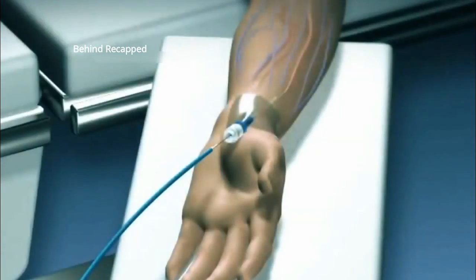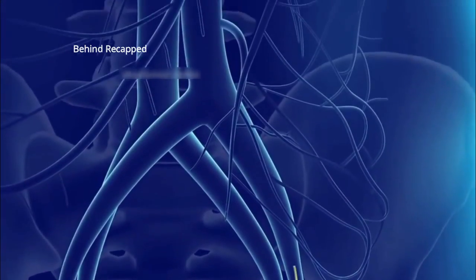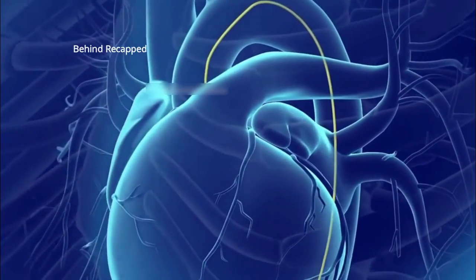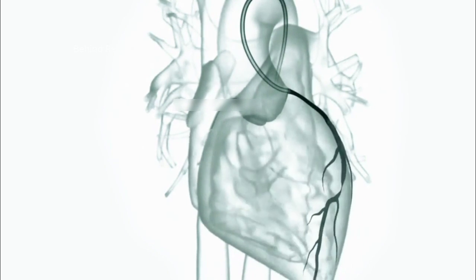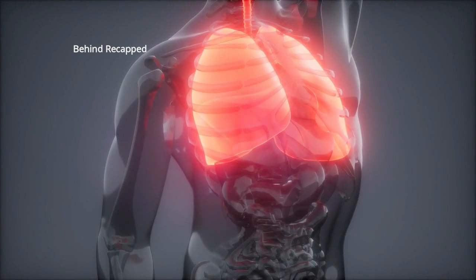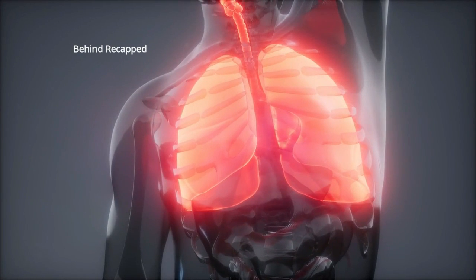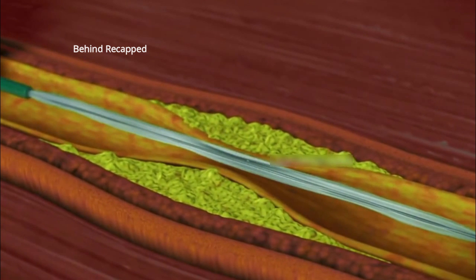Before starting angioplasty, a healthcare professional will clean and numb the area where the catheter enters the body, usually the groin, but sometimes the wrist. Next, a doctor inserts the catheter into the artery and directs it toward the coronary artery, watching its progress on an X-ray feed. Once the catheter is in position, the doctor injects a contrast dye through the artery, which helps locate blockages around the heart. This process is called angiography.